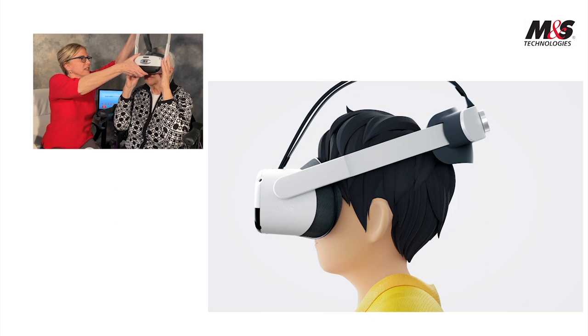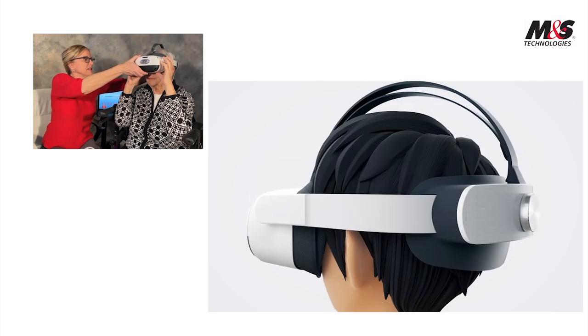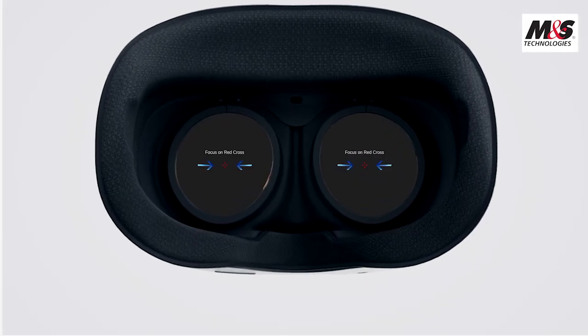Hold it against your face. The strap goes down and it tightens in the back. Is that comfortable? Yes, it is. Now I'll describe the test to you.